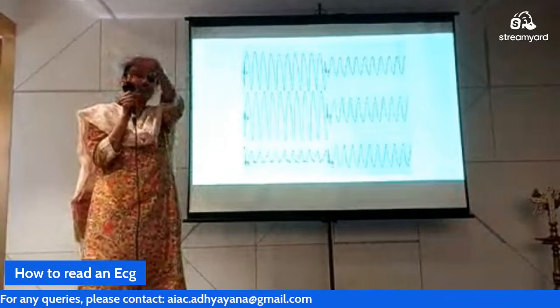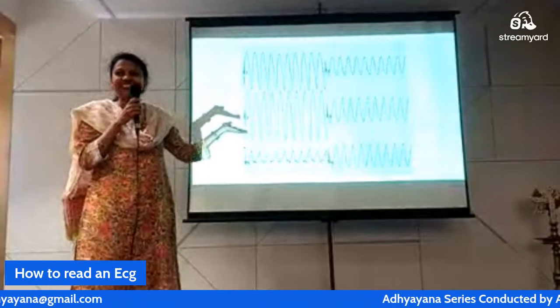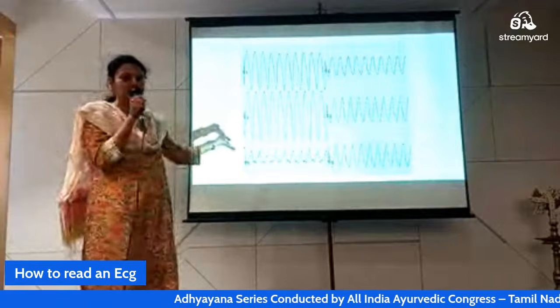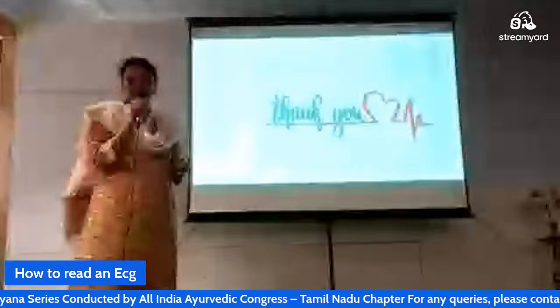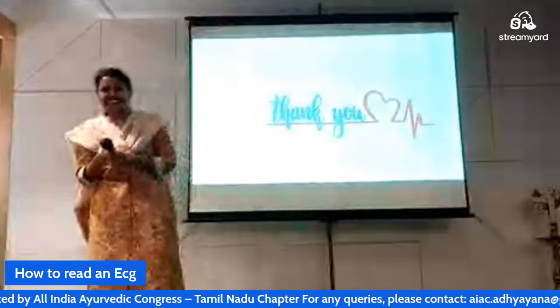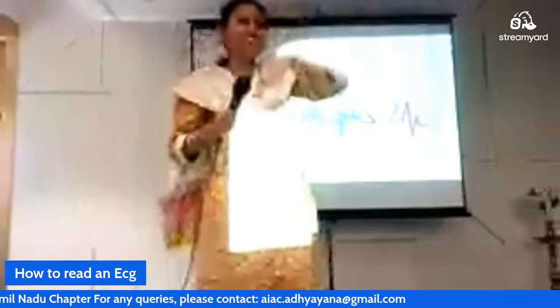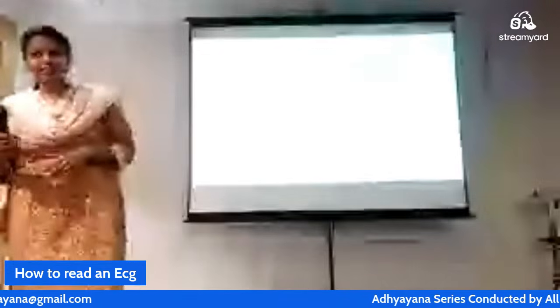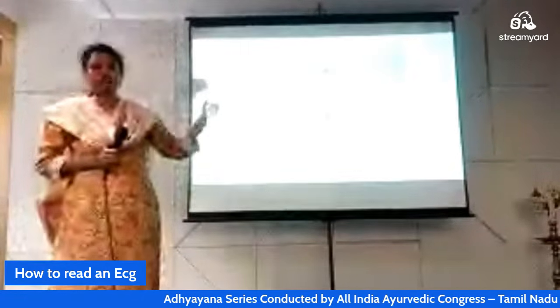And last thing, one question. What is this? Okay, it's a VT rhythm. It's a dangerous rhythm. Okay. Thank you. These are the common issues that I see at my OP level and ICU level.